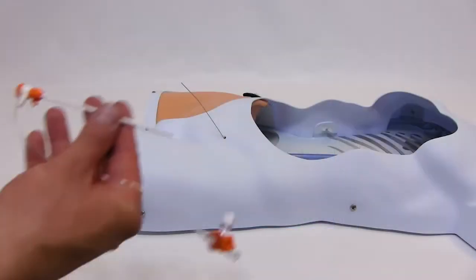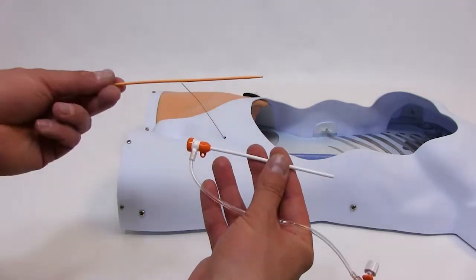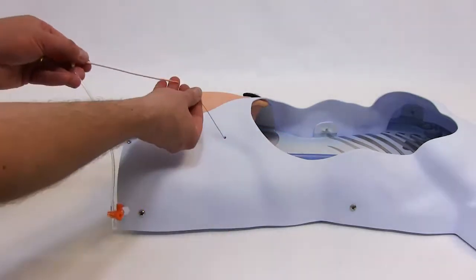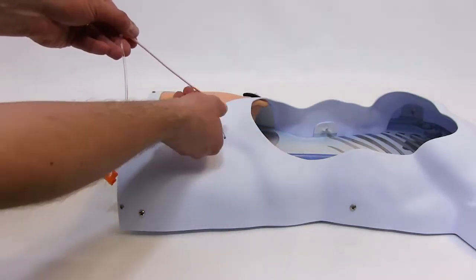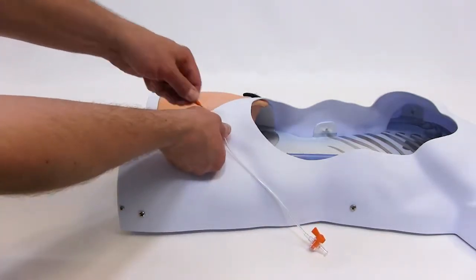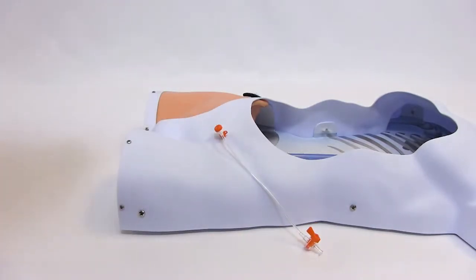Prepare a 7 French introducer sheath by inserting the dilator into the sheath, sliding the dilator-introducer sheath combo over the guide wire, and advancing it until the sheath is flush with the body model's surface. Remove the guide wire and dilator.